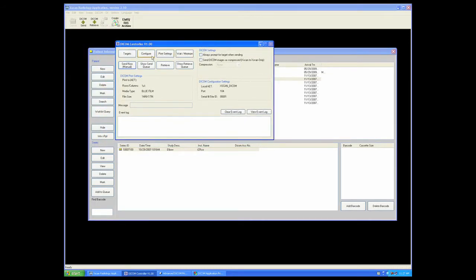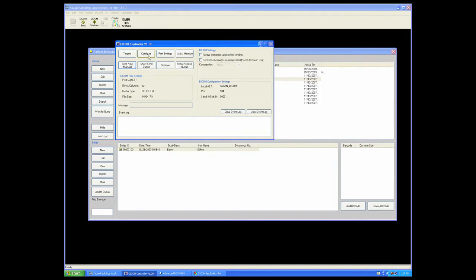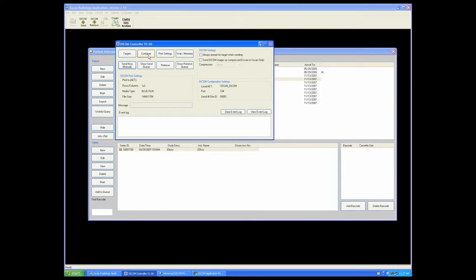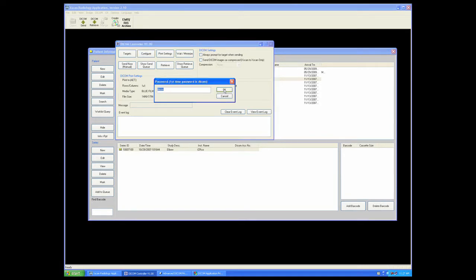The Configure button is used to give this unit, your acquisition station or your review station, whatever unit you're working at, its own separate and unique applications entity title. By clicking Configure and opening the password dialog, it is pre-populated for you.